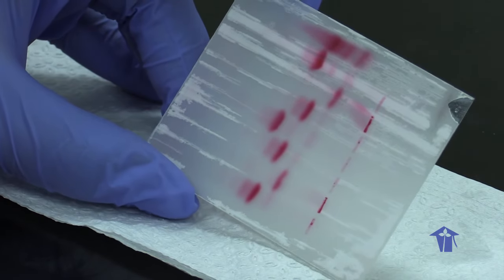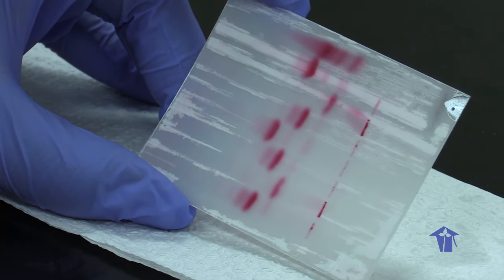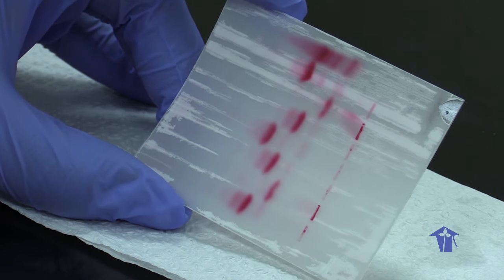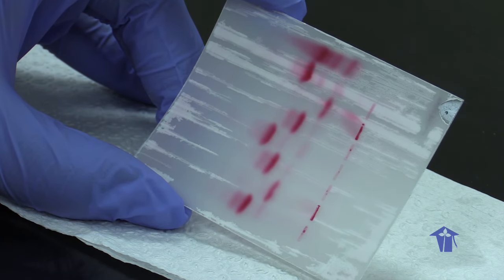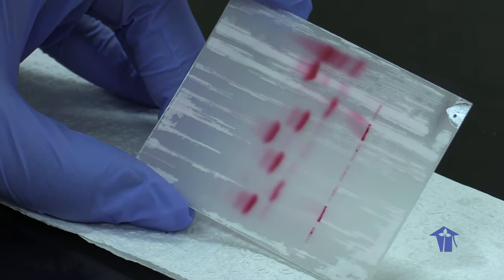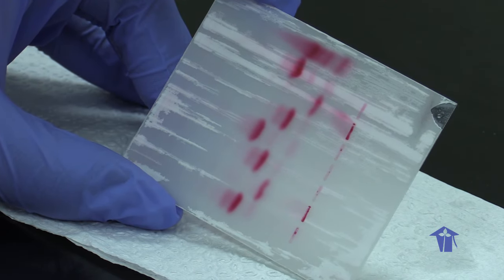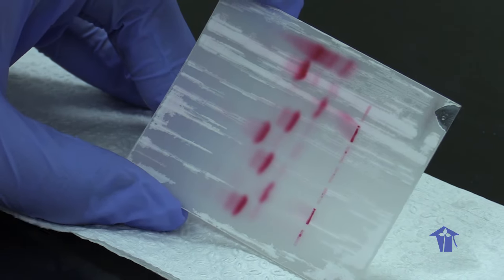One point is that to quantify, we cannot quantify the type of hemoglobin by just looking at the bands. We could say, well, one band looks a little heavier than the other, and therefore there'll be more of that hemoglobin. But there's an instrument called a densitometer, which we can attach to the plate, and you can read the quantity, or determine the quantity of each of the different hemoglobin bands. We don't have that here at the moment.